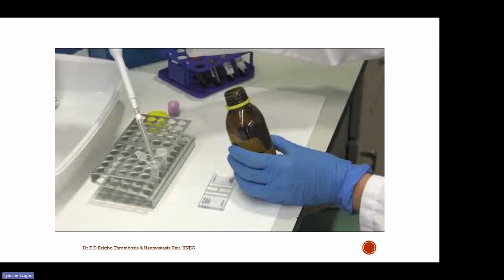Of course, in the manual process, you should know that you count the white cells, which have a different dilution fluid, from the red cells, which have a different dilution fluid, and also platelets. If you want to count platelets, it is the same process, with different dilution fluids. So you prepare each of them individually and repeat the counting individually, just for one patient. So it is quite time consuming, as you've seen for the erythrocytes.